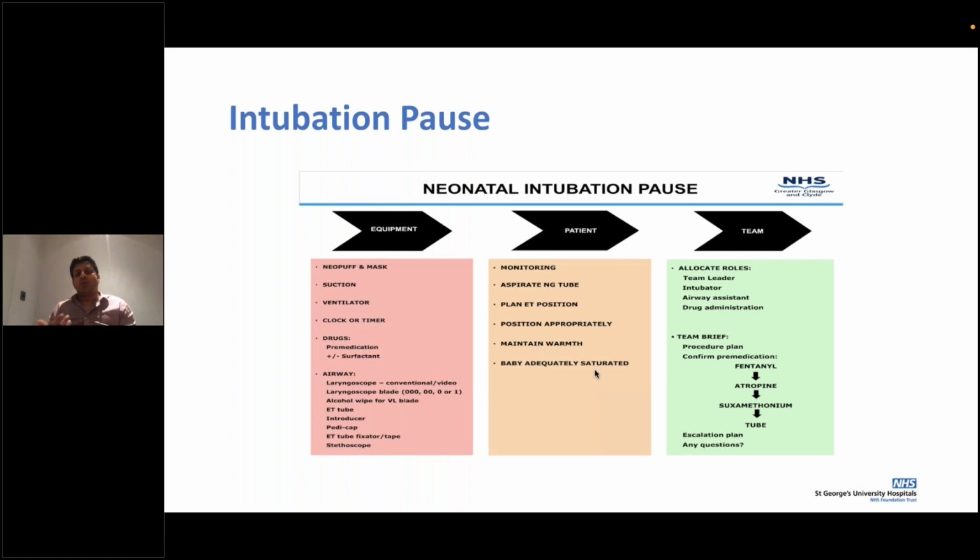Now, once we've spoken about preparation, equipment, and having a pause, the absolutely essential thing is that when I say pause, the decision of intubation has been made.